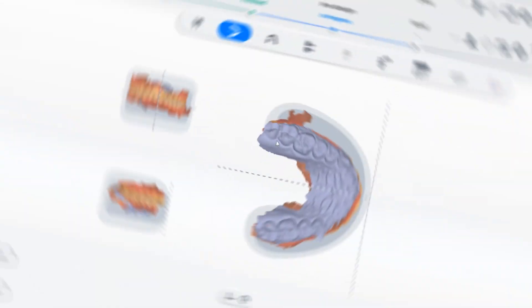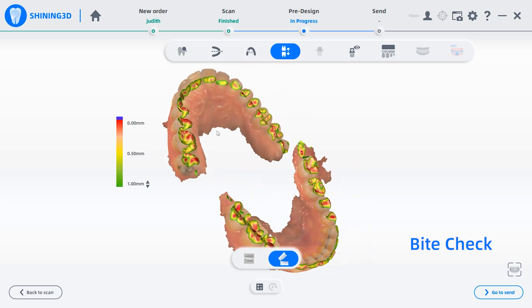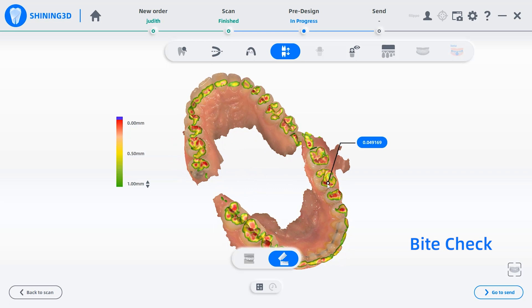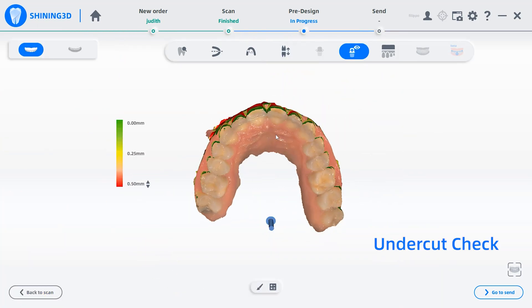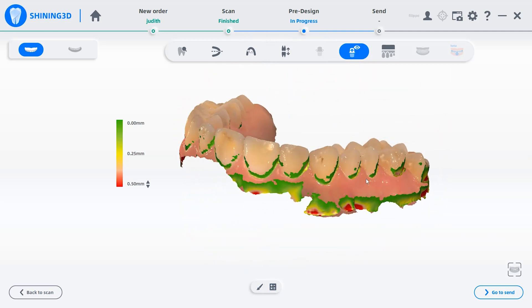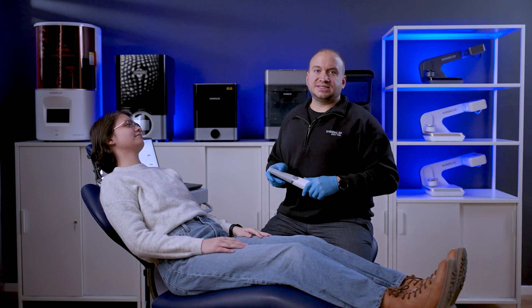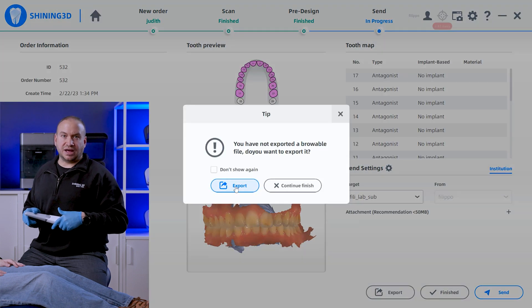The next functions I'm going to show you are optional for the dentist. And finally, let's upload the case on the cloud. As always, the doctor has the cloud option to send the file to the dental lab.